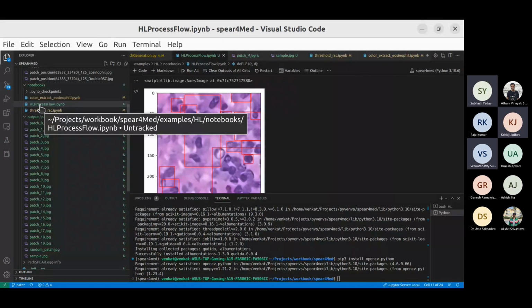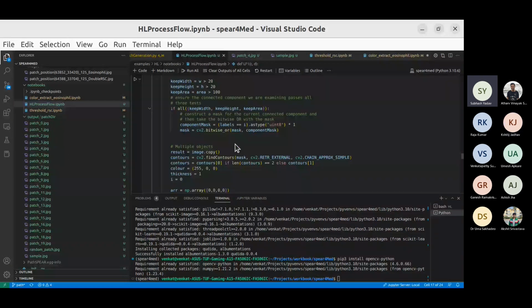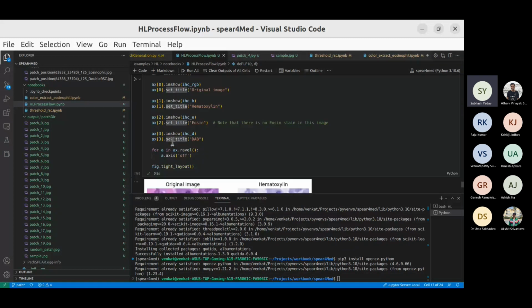And one more thing, in the last meeting we had discussed CD3 and CD8 also. There were some labeling functions available for CD3 and CD8 that you had shown us. Yes, CD5 and CD8. So what I see on the future side is that we will have to apply those also in our functions so that we get more segregations, because the lymphocytes are CD3, 4, 8 positive, and that will also help us that way.